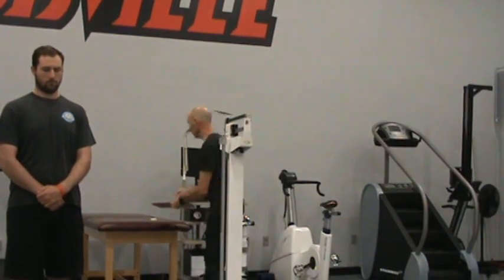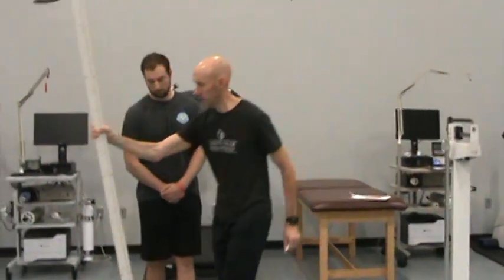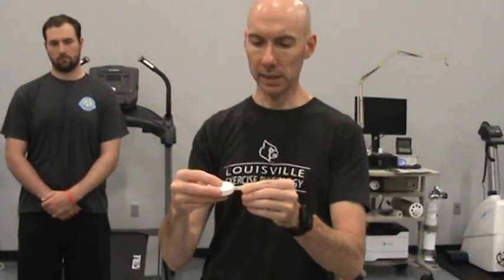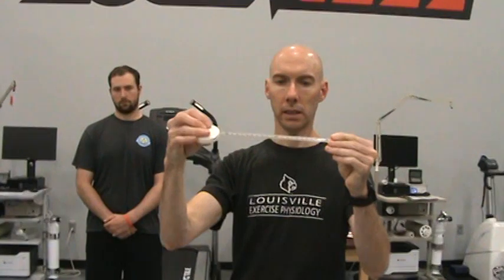The next measurement we're going to take is the waist and hip circumference. To take anthropometric measurements, we use an anthropometric tape measure, which is a spring-loaded flexible tape measure. Notice it has inches on one side and centimeters on the other. We will typically take measurements in centimeters because the ratios are calculated using centimeters. The two we're going to learn are the most commonly done: the waist and the hip circumference measurements.